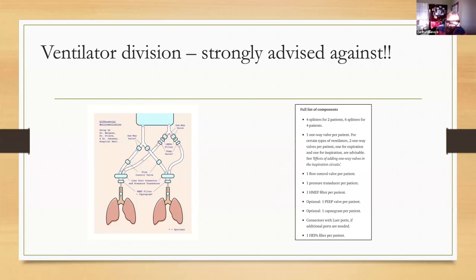The next question was, if I remember, on volume control versus pressure control. I think the mode we should probably use is volume control. The reason is that this is the most studied mode. All the ARDSNet trials were done under assist control volume mode, where there is a set rate and a set tidal volume. The ventilator will give the same volume every time, initiated by either the ventilator or the patient. If the patient tries to initiate a breath, it will give 500 ml; if the ventilator initiates when the time comes, it gives the same. Volume assist control is what we studied, and it guarantees volume.